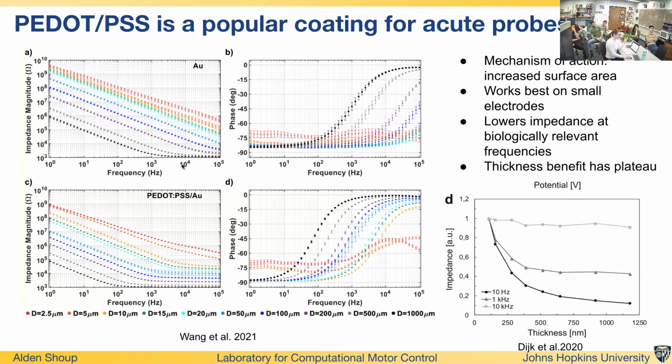And so if we were to get a neuron with a frequency signal component of around 100 or 1,000 hertz, you're going to look at this frequency band here as what the characterization is, how that will affect how you pick up the signal. And the impedance magnitude is just a measurement of the magnitude of the wave that comes out that we're measuring through the channel or through the electrode.